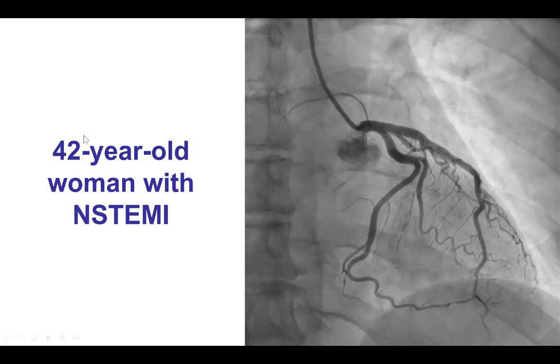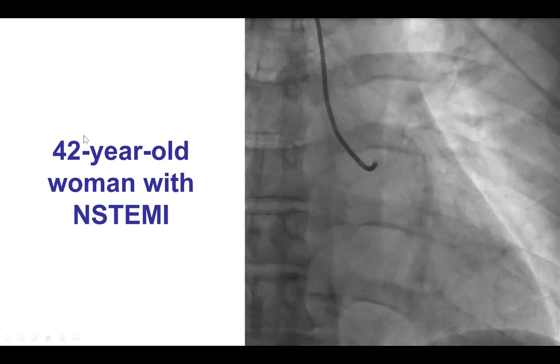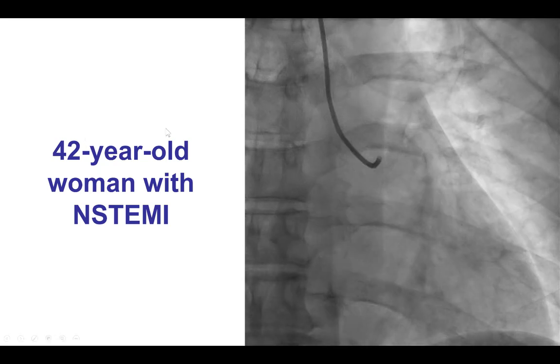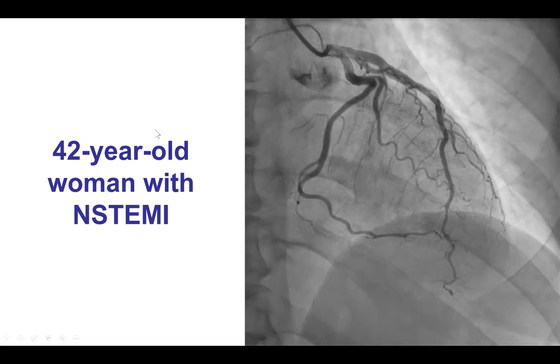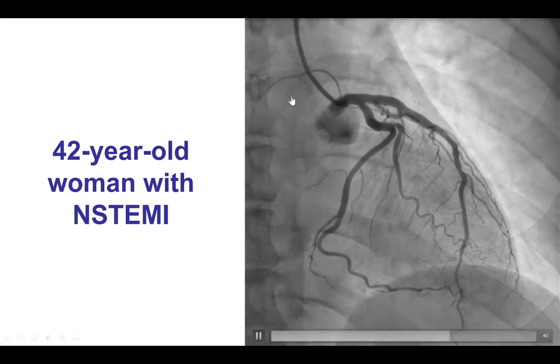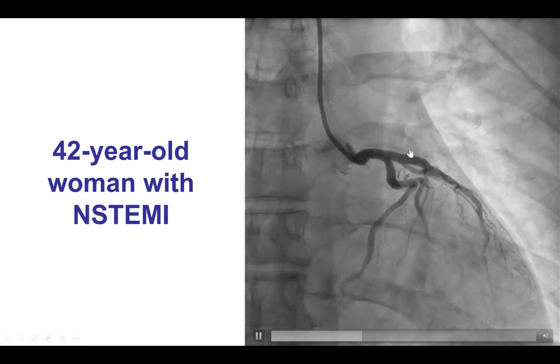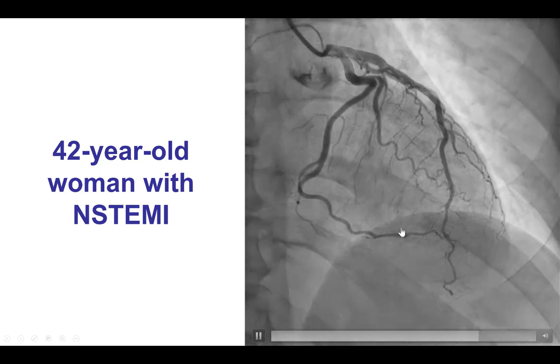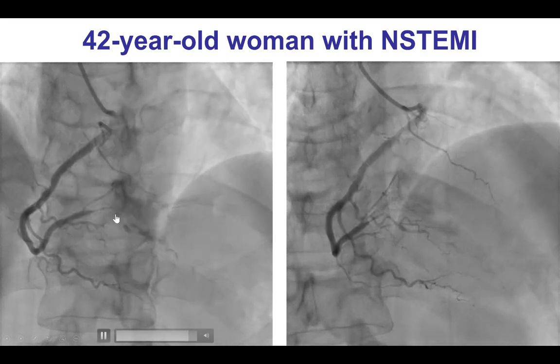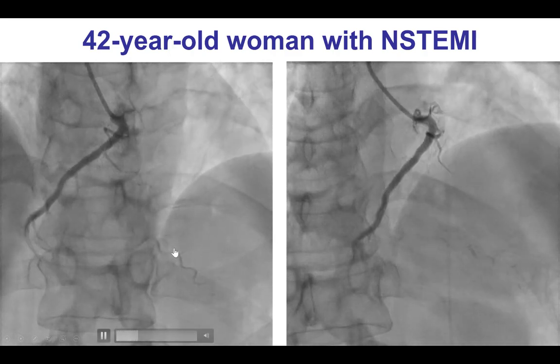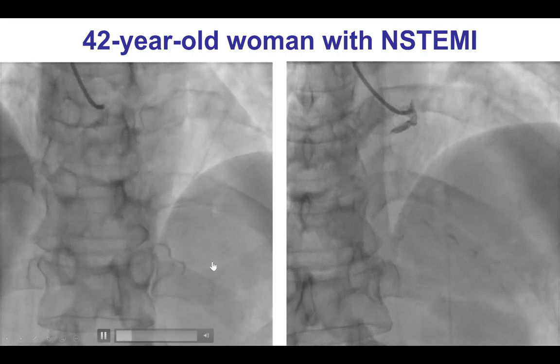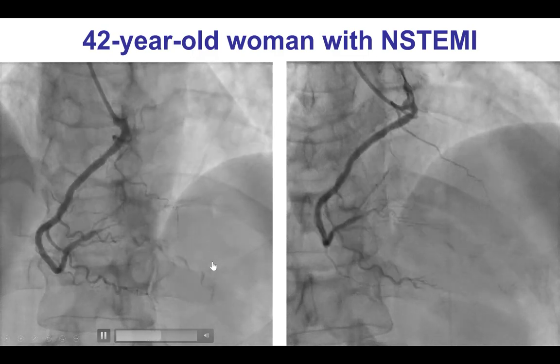The patient was a 42-year-old woman who presented with non-ST elevation myocardial infarction as well as ongoing chest discomfort. Access was obtained through the right radial artery, which may be an issue as we will discuss later on. Coronary angiography of the left system did not show any significant lesions. However, angiography of the right coronary artery demonstrated occlusion of the posterior descending artery. This seemed to be diffuse and in a pattern that is characteristic of spontaneous coronary artery dissection.